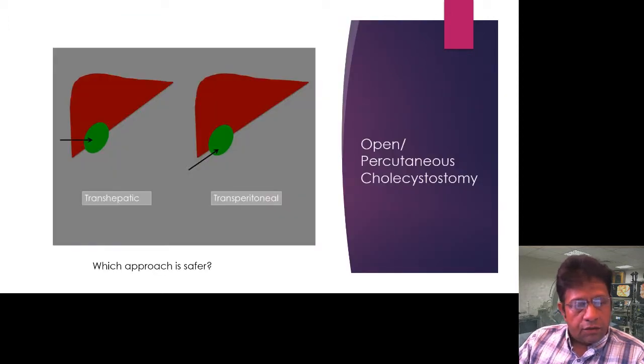Okay, so the first area that we're going to look at today is the percutaneous cholecystostomy. This is a procedure that's done in a patient who is acutely ill. They usually have some type of infection of a stone in the Hartmann's pouch, and they are usually too sick, unfit, unstable for a cholecystectomy, and so they require a percutaneous cholecystostomy. This may frequently be done in an ICU setting, not in theatre. It's usually ultrasound guided.